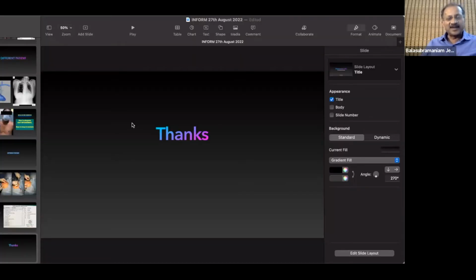The only step which looks tricky is that you don't have a tunneler. So is it always easy to push the catheter from down up? Yes, sir. If you do a few catheters, you know the tricks of the trade. You can use the small dilator tip and pull it, or use mosquito forceps, or if you have preserved some dilators or the trocar of the tunneled dialysis catheter, you can use it and pull it out.